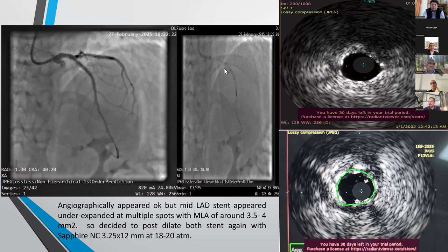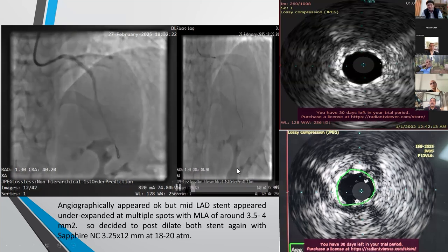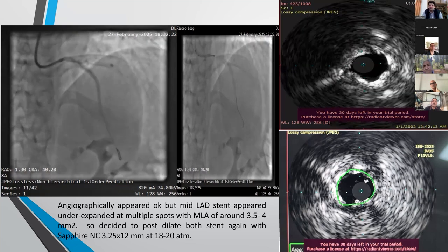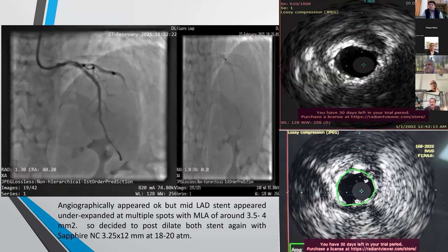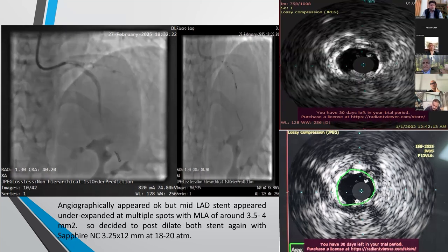For FFR, IFR wire, I've never reused a wire. I know technically it does not have a lumen, so from a sterilization standpoint it might be easier to reuse. I've never done it because even when you reconnect the transducers and hook it up for remeasurement, you have a lot of issues getting proper measurements. With sterilization, I'm not sure how accurate and reliable those readings will be. Because those transducers are so sensitive, I wouldn't use it for reuse purposes. And personally, when I have used them, I use the reused wire only to test the system.